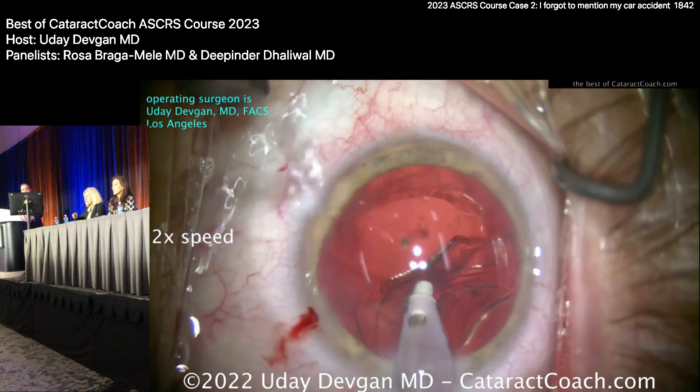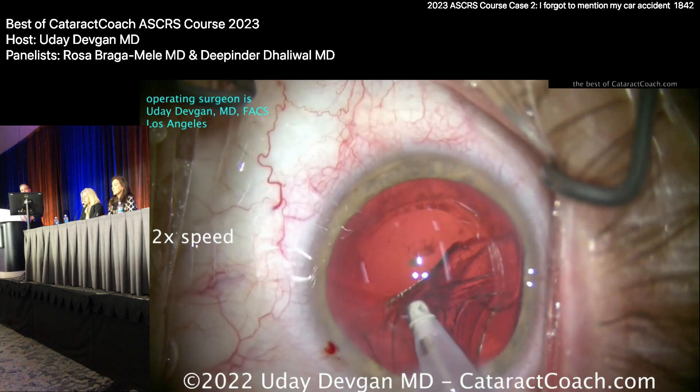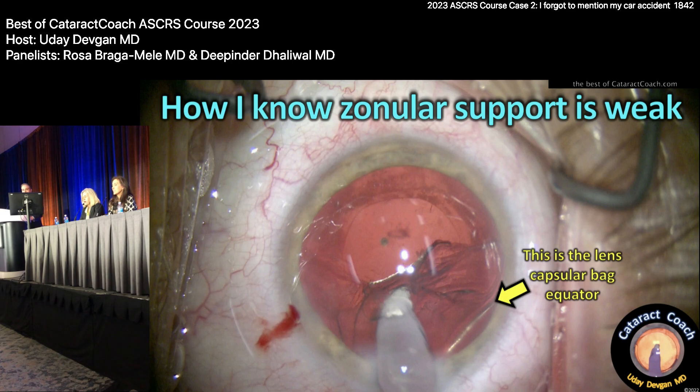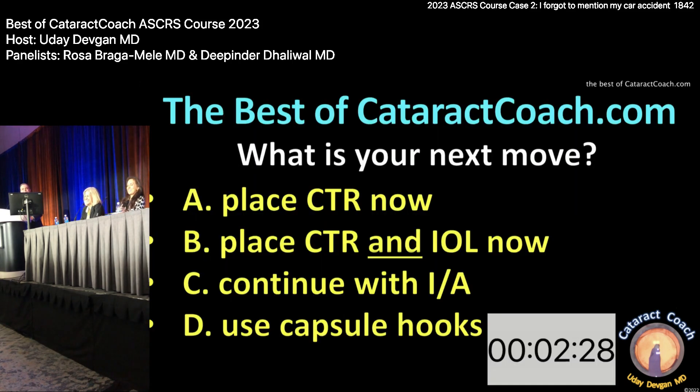Oh, that looks bad — I should probably let go. There's the bag equator. Did I come right out of the eye? What do I do now? Place the CTR. And inject viscoelastic — don't just come out of the eye. What you should do there is stay in the eye on just irrigation or zero foot position so you don't decompress the chamber and get vitreous coming forward, then fill the bag up with viscoelastic.